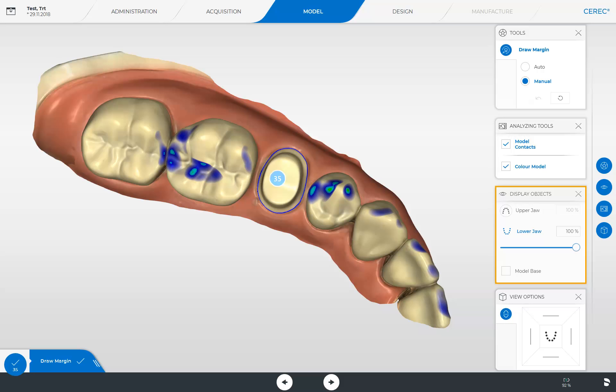The Display Objects window contains the buttons Upper Jaw and Lower Jaw, as well as a slider. Next we continue with the View Options window. Here we see the global view options, which include Top, Bottom, Right, Left, Front, and Backside. It lets you switch from one view option to another with just one tap.